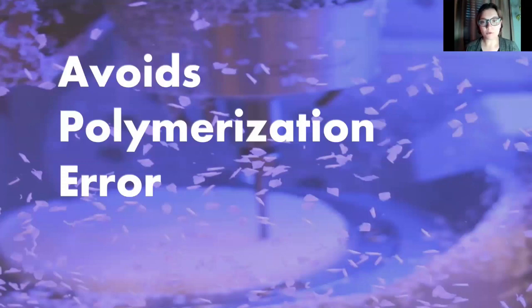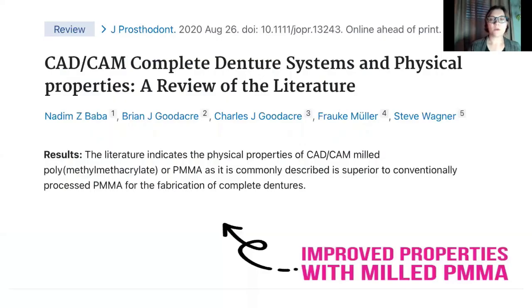We talked about the polymerization error. That's when the cast pulls away while it's being processed. With milling, again, the processing is all done, so you don't have to worry about that misfit that happens sometimes with processing error. There have been a number of studies that show the improved physical properties, particularly with milled dentures. It shows better fracture toughness, less porosity, less Candida albicans adhesion. So it's kinder to the tissue, we see healthier tissue and fewer fractures.